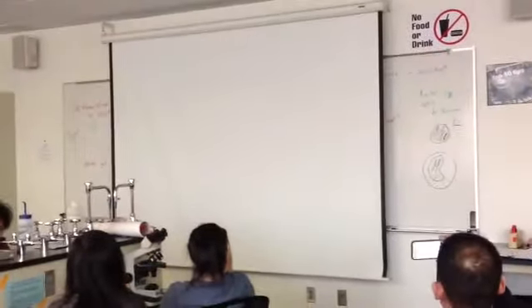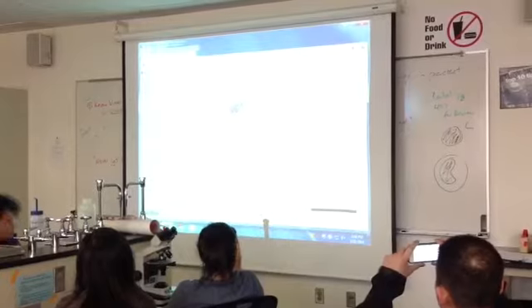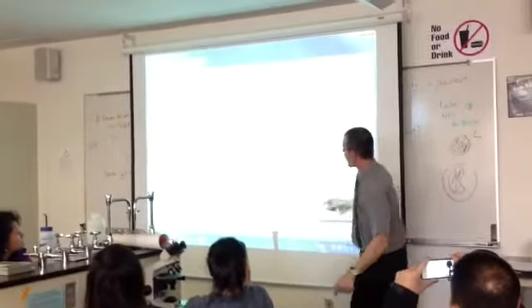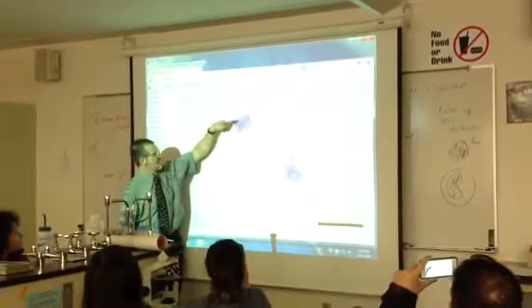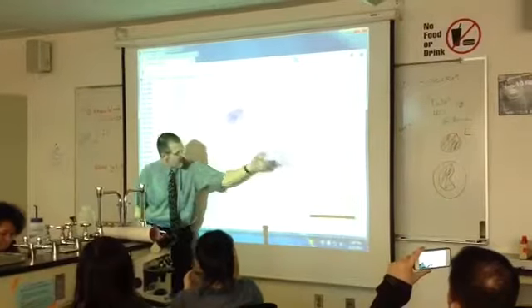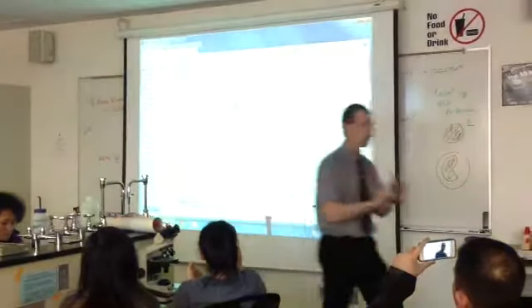Let's go. Upper left, name it. Monocyte. Middle one, name it. Monocyte. In fact, he's oozing over there. But again, bigger than those, normally kind of kidney bean, horseshoe-shaped nucleus that takes about half-ish of the cell. Normally, this one's a little different, but again, you get the gist. That's not a lymph, it's not a neutrophil. No speckles. Right, so use all the clues.